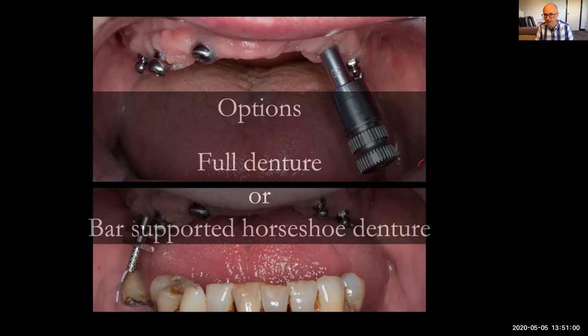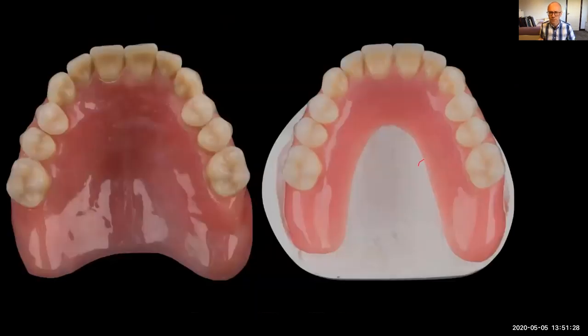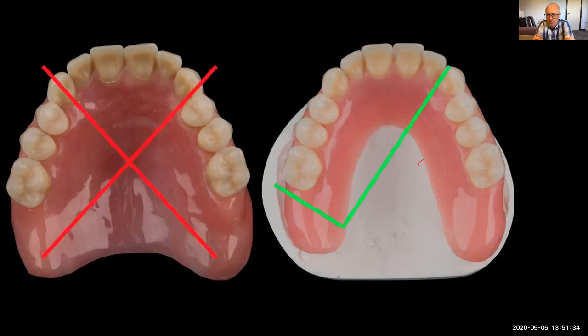So we've got the options here. Number one, a full denture. That means we take all the studs off and I just do a lovely upper denture with good suction, a full one, normal. Or if she wants a horseshoe-shaped denture, we make a bar that fits onto the existing implants, not the Friolites, just those back ones, and then we can do a horseshoe. So she went away and thought about these two options and then decided to go for the horseshoe-shaped denture. That's what we went ahead and did.